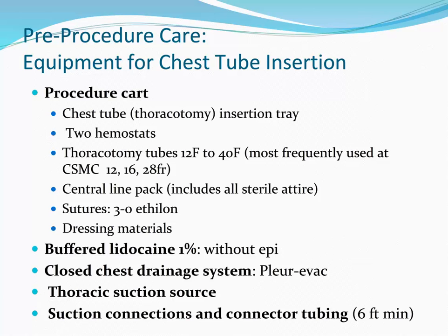First, focus on what equipment you will need. This is really important because your first line response in an emergency is to call thoracic surgery and make sure you have a credentialed provider on the way. They will arrive in minutes and you must have all the equipment at the bedside. Get another RN or CP involved. Here is what you will need.